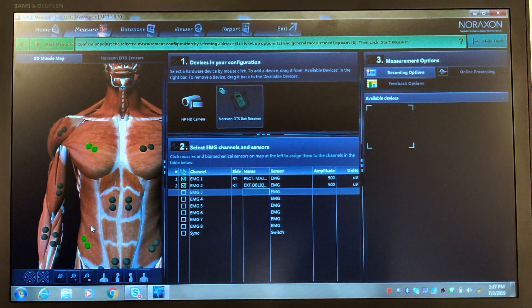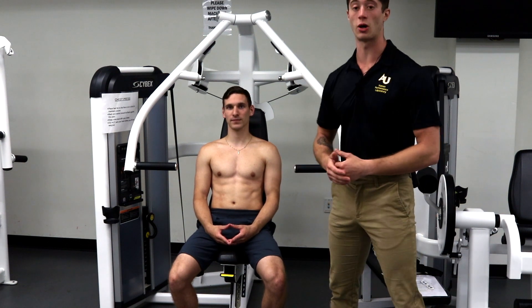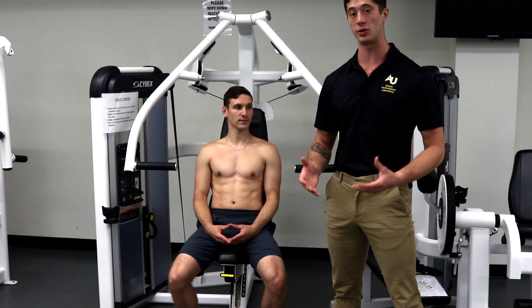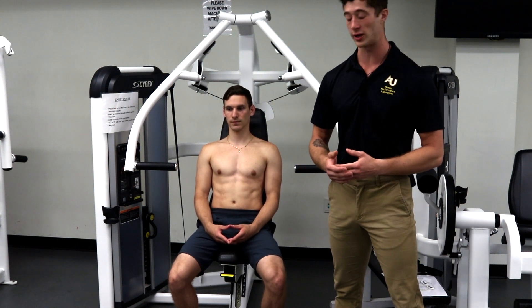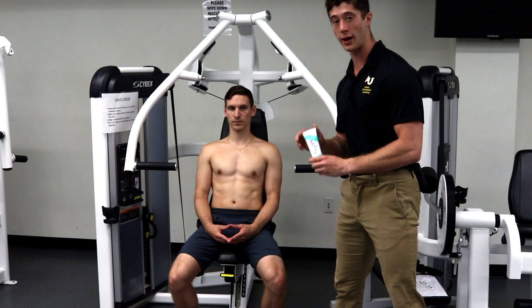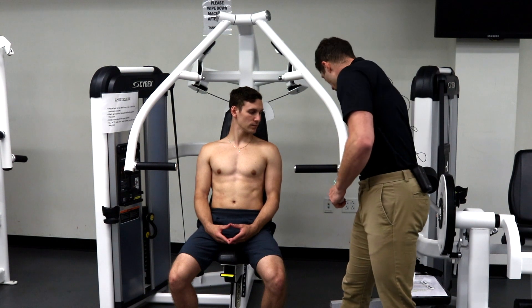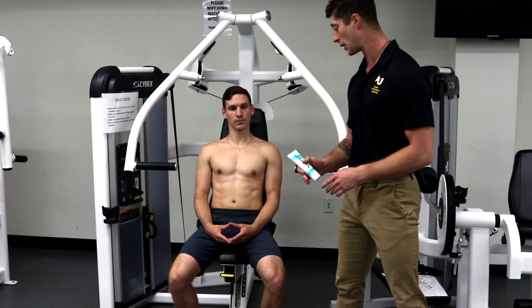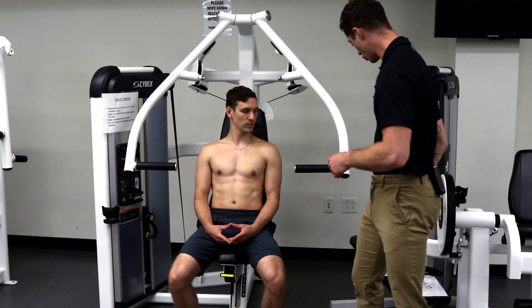Now that Peter is in position on the chest press, we can get started prepping him. It's important to prep the individual in the position they will be in during the exercises being tested, otherwise you may not get an accurate reading. We'll need new prep as well as rubbing alcohol to prep the areas where the electrodes will go. We'll use new prep to abrade the skin until it's light pink so the electrode gets a good sticking point, and rubbing alcohol to clear off any excess debris.